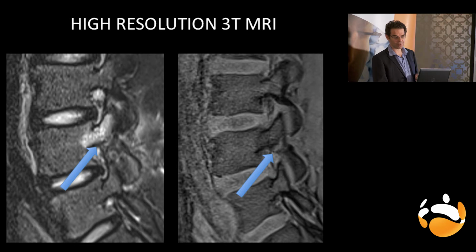We've done a research project comparing CT to MRI to this VIBE sequence, and we've shown excellent results with the VIBE, and it's currently been submitted. We're awaiting acceptance from the journal.